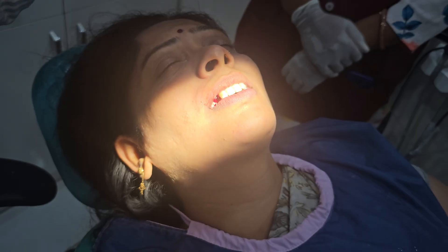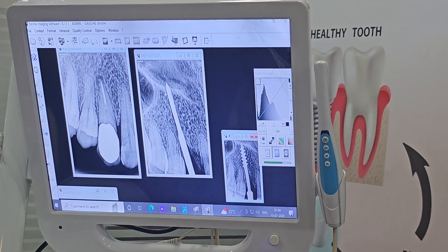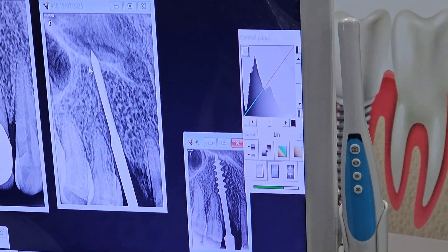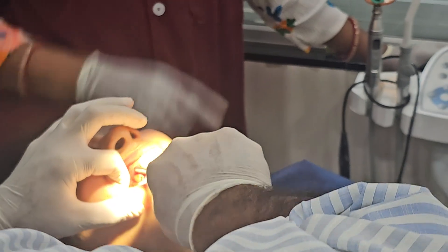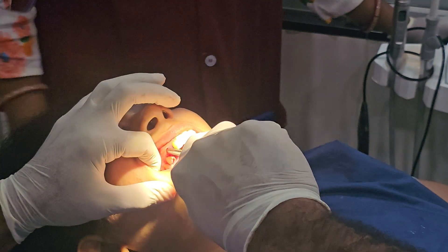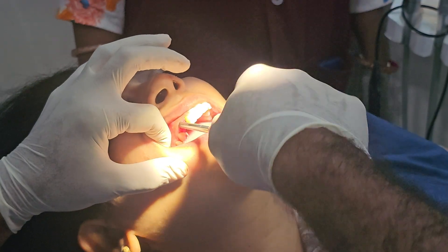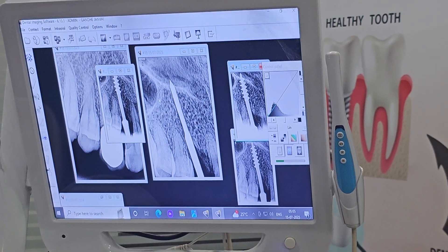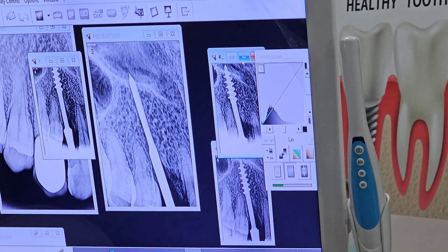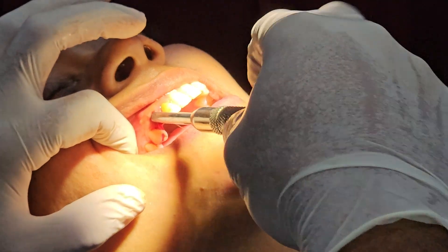Now we will take an x-ray. The implant has reached the cortical bone but has not engaged it — it is short. So we will push it a little further. We are getting very high torque, so I have to loosen the bone a little bit to go deeper. We will take another x-ray. We have just perforated the cortical bone and we are getting very high torque. This is the ideal placement of the implant.